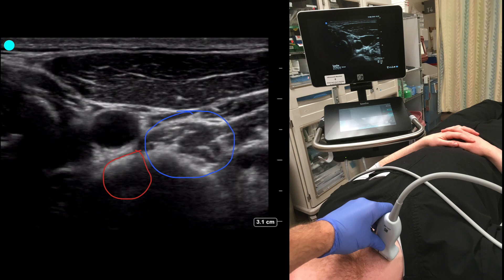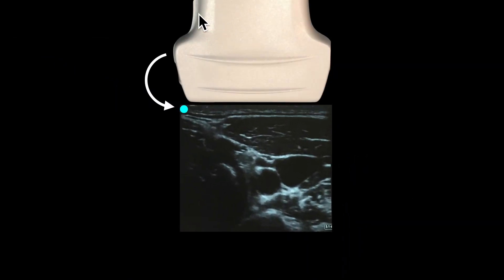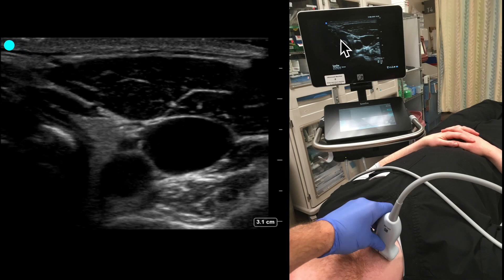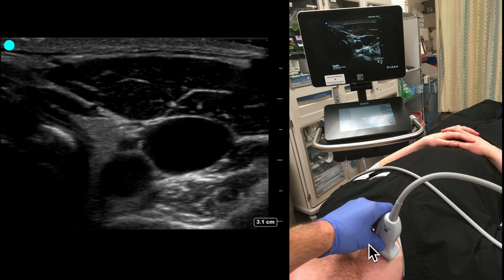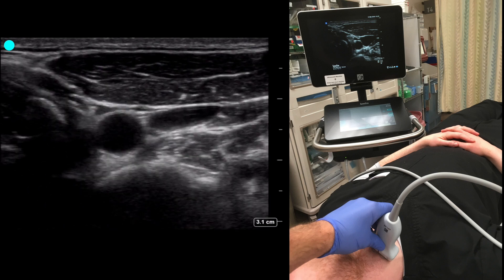What we have to keep in mind is that our screen correlates with the probe marker — they both match. In the case of the right IJ, this side would be the patient's left and this side the patient's right. We can see the probe marker direction, and on this image the trachea is here, there's the carotid, and then there's the IJ — the same correlation we see on the patient. Once again, we're going to make sure it's a compressible vessel before we ever attempt access.